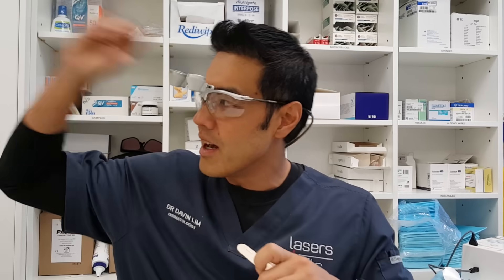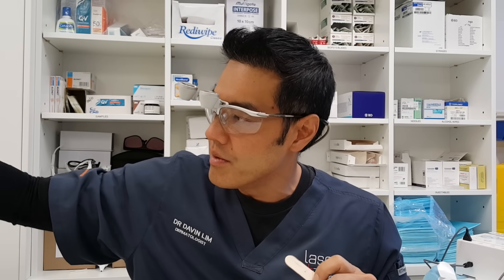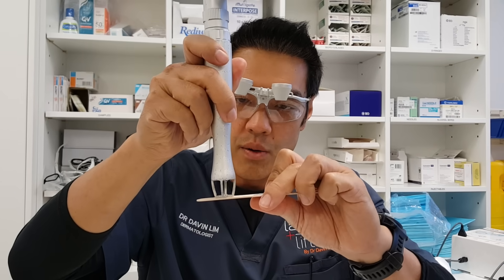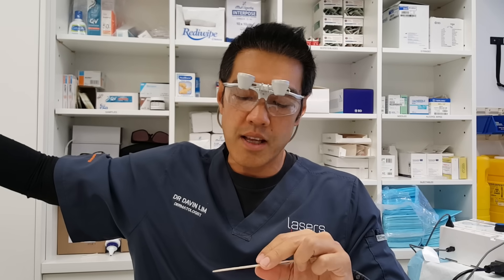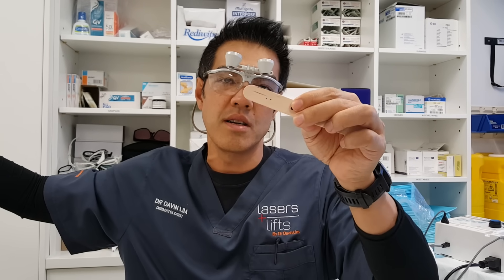My favourite method is to give the least amount of collateral damage to the tissue — I don't like causing damage to the surrounding skin, that's why I use a laser. Lasers are extremely accurate and very powerful. You can see here, we're already through — it's a very precise instrument, gives minimal collateral damage, just a dot. It is an amazing tool for extractions, and coupled with a cup extractor it does a really, really good job.